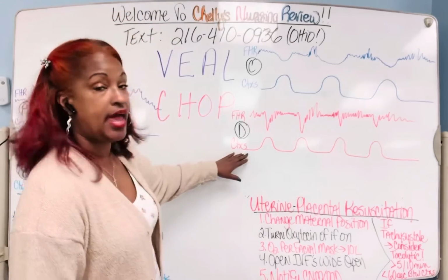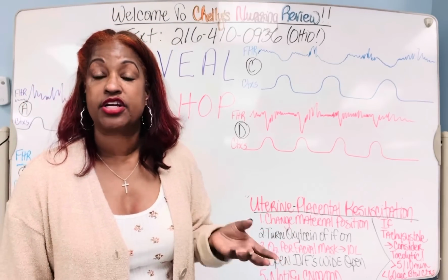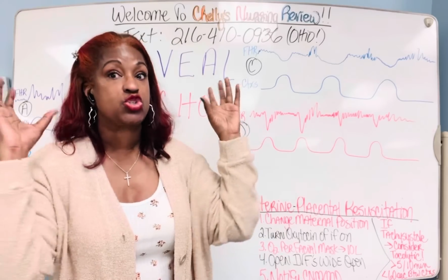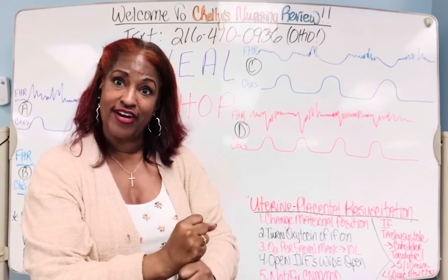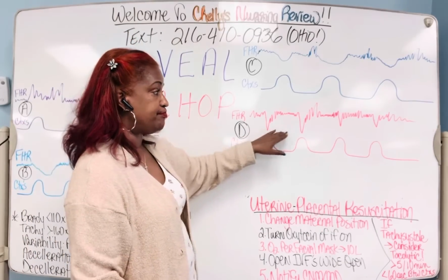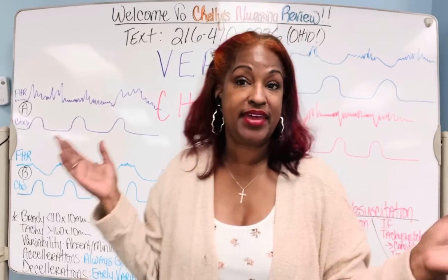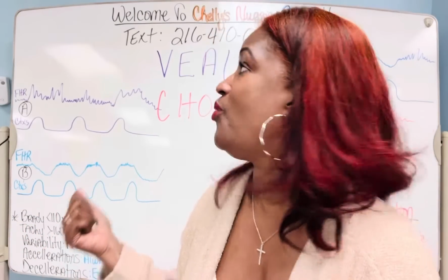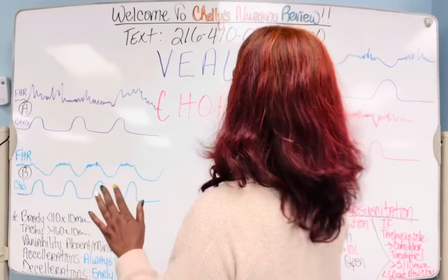She's strip letter D because without much amniotic fluid, every contraction that she has squeezes the cord. It compresses the cord and gives variable decelerations. Okay, that was a mini quiz. Let's jump to why all of this makes sense at the end of it, right? Let's go ahead and get started.